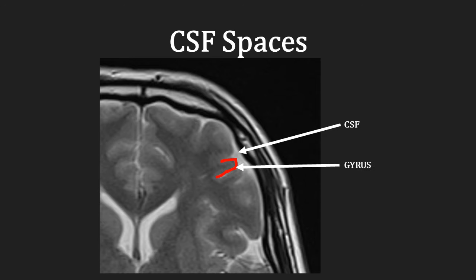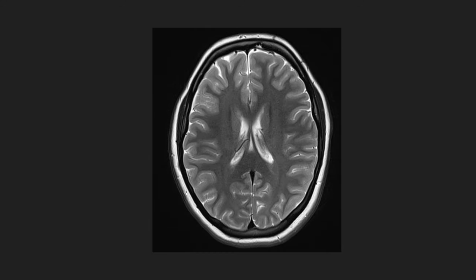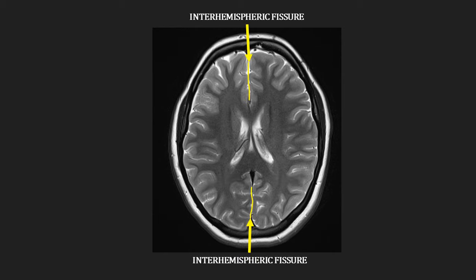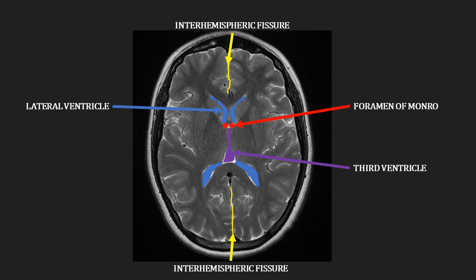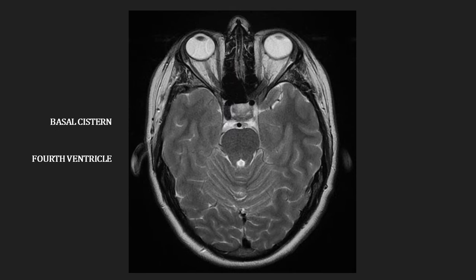In between the folds of brain, or gyri (plural for gyrus), are CSF-filled spaces called sulci (plural for sulcus). Taking a closer look at the CSF spaces in the brain, the interhemispheric fissure in yellow separates the two hemispheres, and the lateral ventricles are paired spaces on either side of the brain, represented in blue. The lateral ventricles communicate with the purple third ventricle via the foramen of Monro. The sylvian fissures, highlighted here in orange, separate the frontal and temporal lobes. CSF in the basal cisterns, highlighted in green, surrounds the brain stem, and the fourth ventricle, shown in dark red, communicates with the third ventricle.